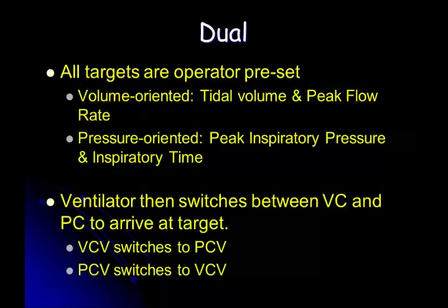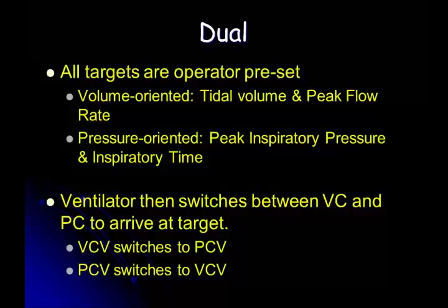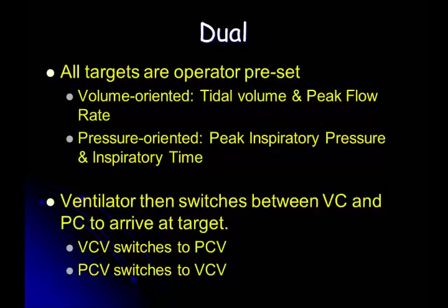Jackie's question was very intuitive. She said, why would you want to have anything other than volume? You're guaranteeing a tidal volume being delivered. But the downside is that the flow rate is fixed. And to be honest with you, volume orientation, up until about probably 10 years ago, is all we did in the adult world. That's all we knew. Babies, we only knew pressure. And of course, the two of them never talked to each other.